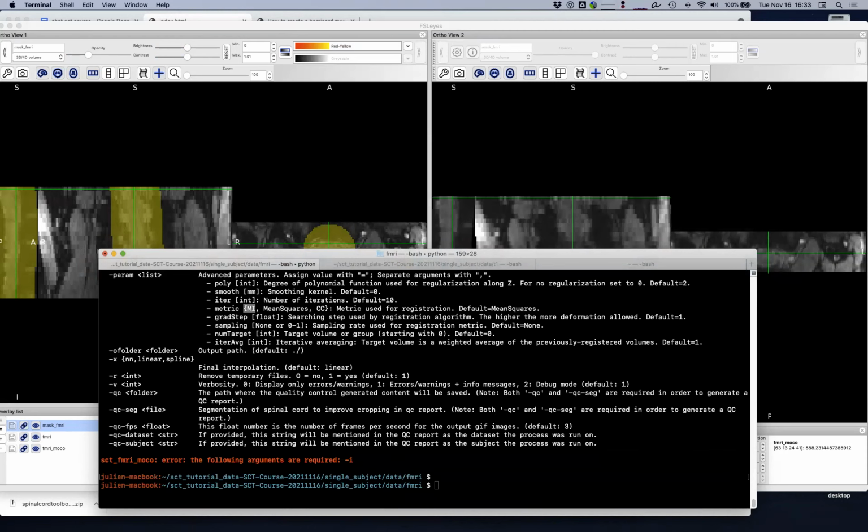Sorry, I just wanted to say, Julian, I believe what you said is completely correct. I spent a lot of time fiddling with motion correction and the size of masks. Initially, I thought that making the mask smaller would be the best way to go, and that was wrong. When I made the mask a little bit bigger, it actually didn't make a huge difference because the area around the cord was black because of the bones. You're basically adding zeros, which doesn't change anything.